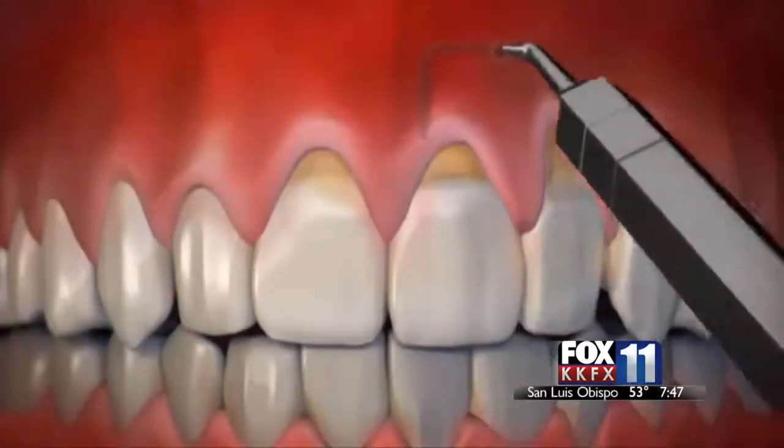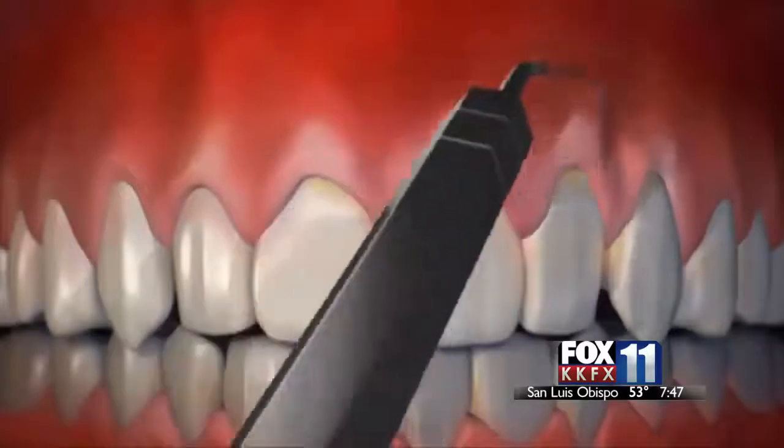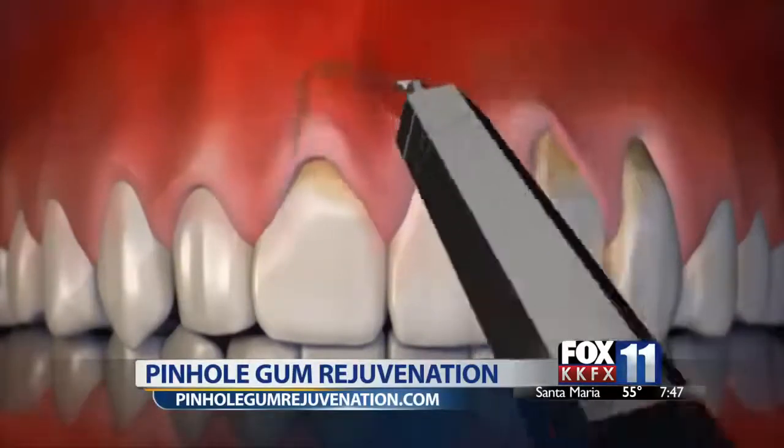Yeah, well, it's quite simple because the gums are numbed up, and we put a tiny little pinhole above where we want to treat it, and we use specialized instruments that I invented. Basically, we lift the gums from the underlying structure and let them drape down to where they belong. Because it's still a little loose, through the pinhole I put collagen underneath it and stabilize the gums where they should go. Because there's no stitching and no evidence of cutting, when the patient smiles, it looks like the gums are at the right place. It's totally rejuvenated.